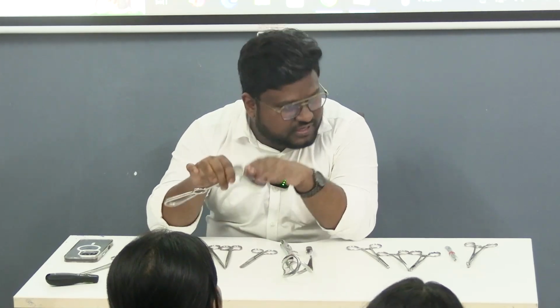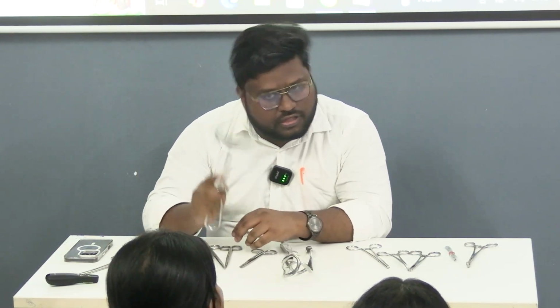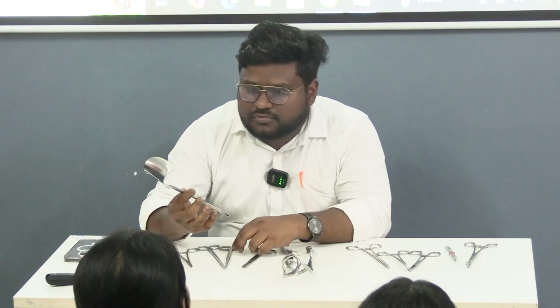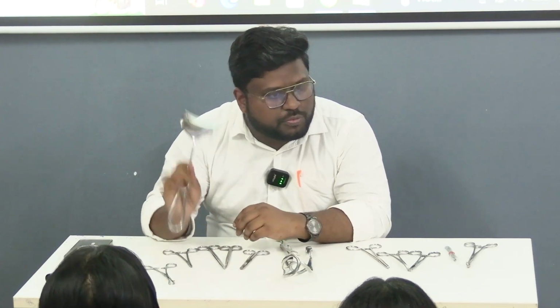During doing a cesarean section, you saw the cesarean section. When do we put this? When do we insert this? When do we remove this? And when do we reinsert this? We introduce it before giving the uterine incision to retract the bladder. When do we remove it? You are not careful. বাচ্চাটাকে বের করার আগে, once we get the baby in our hands, we are going to remove this.